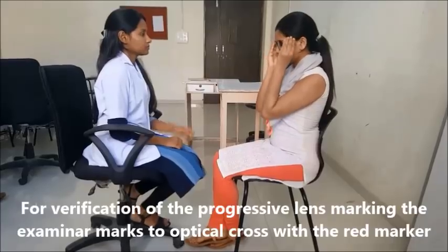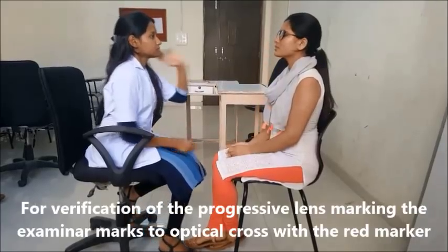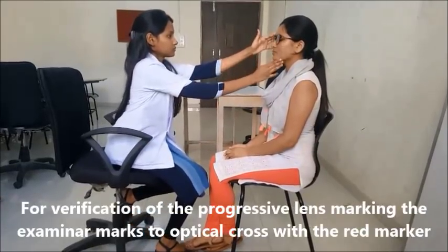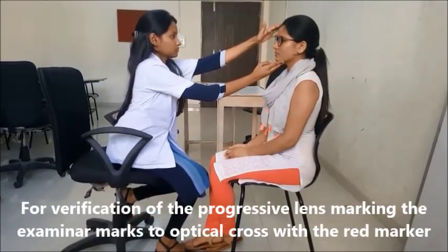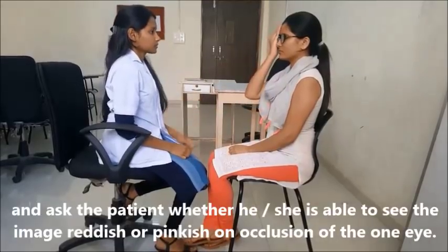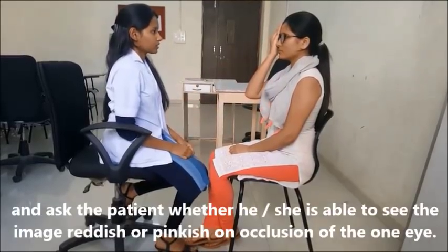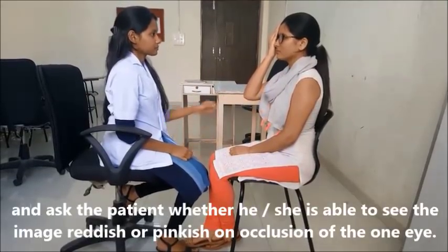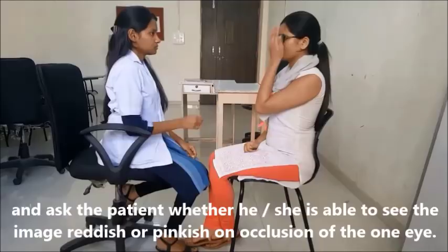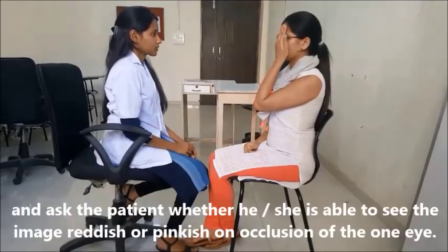For verification of progressive lens marking, the examiner marks the optical cross with the red marker and asks the patient whether he or she is able to see the image as reddish or pinkish on occlusion of one eye.